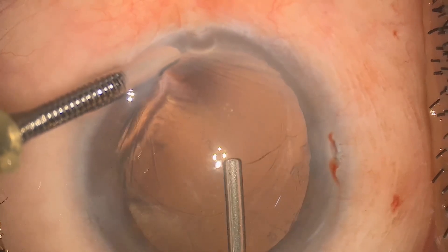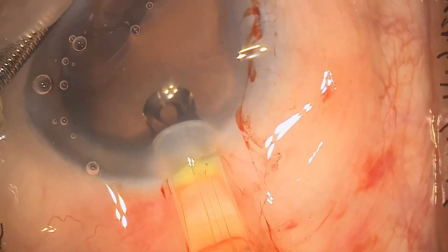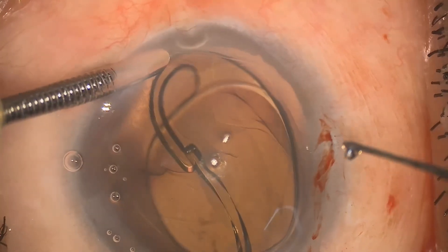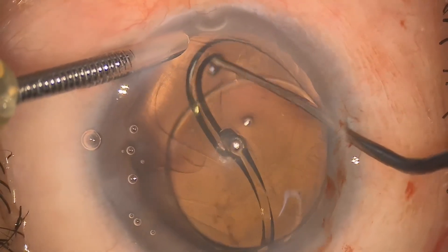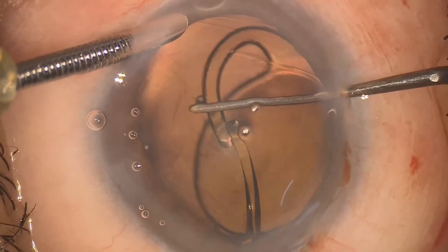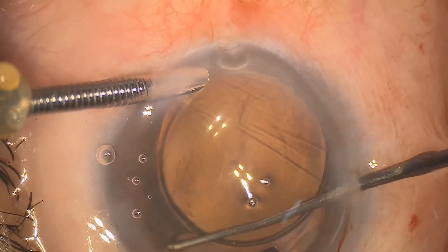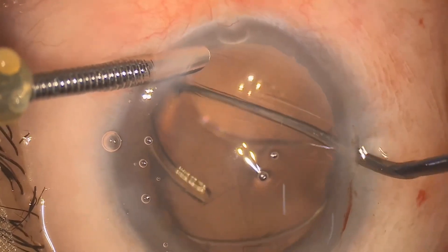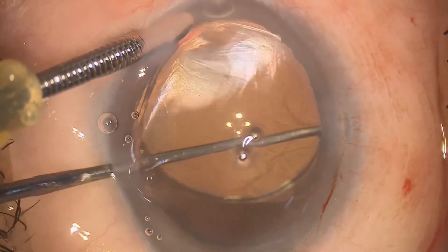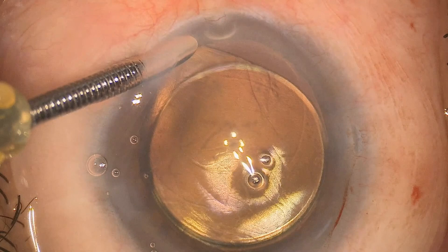Now comes the key part — inserting the IOL. Before insertion we will make sure to inflate the capsular bag properly with viscoelastic. We start putting the IOL inside the bag, with the primary aim of placing the first leading haptic inside the capsular bag. With the use of a dialer we insert both haptics inside the bag. The aim should be that one of the haptics stays at the zonular dialysis area just to further strengthen that area. As you can see both haptics have been separated, and with the dialer I place the haptic at the zonular weakness area. The IOL is now well centered and inside the capsular bag.